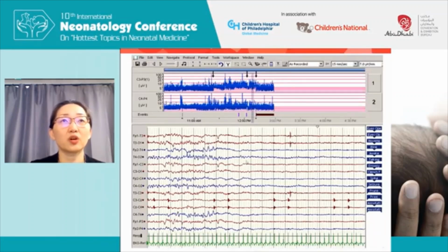This is a patient who's on ECMO or had severe PPHN. They were placed on EEG due to concerns about their neurologic status. At this first black arrow is when the vital signs and clinically the patient became unstable, and the team made the medical decision to initiate ECMO. The second black arrow, you see a sudden flattening of the EEG tracing, suggesting the baby's in trouble. And then the third black arrow is when the EEG was disconnected for cannulation.